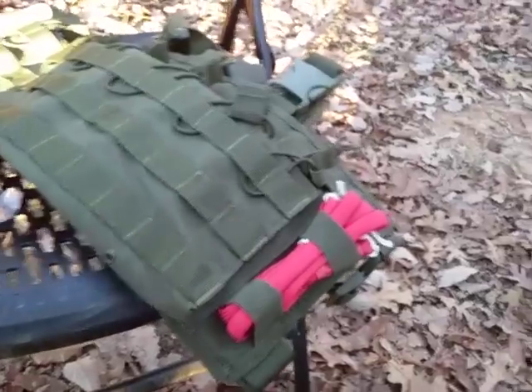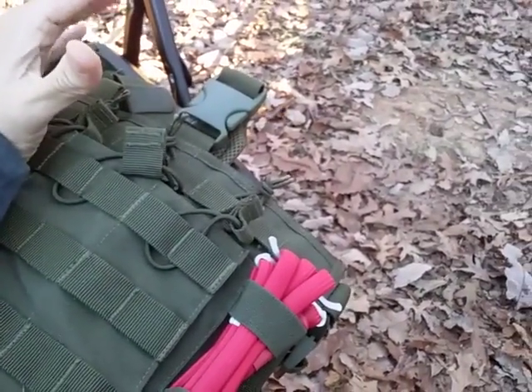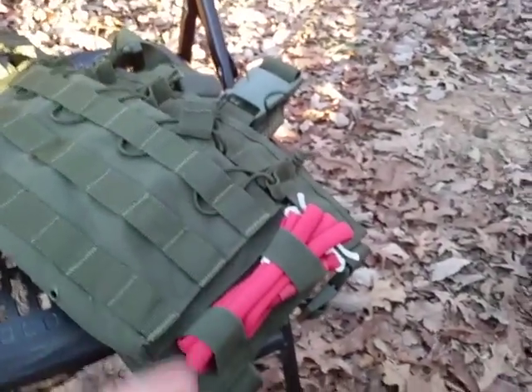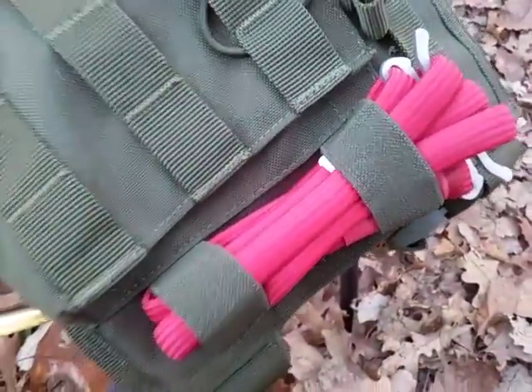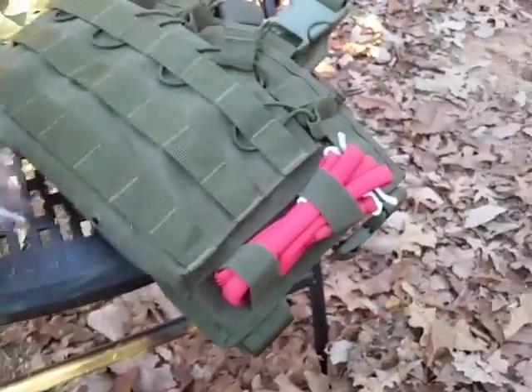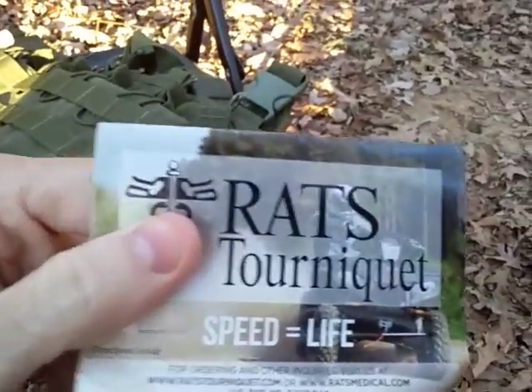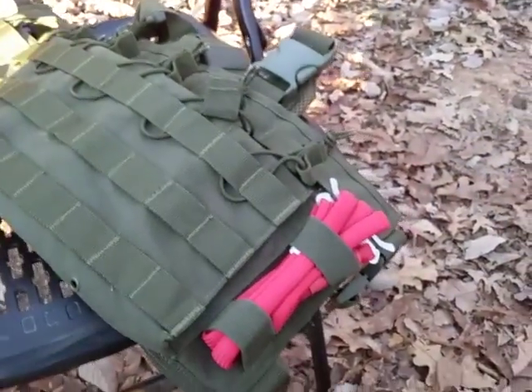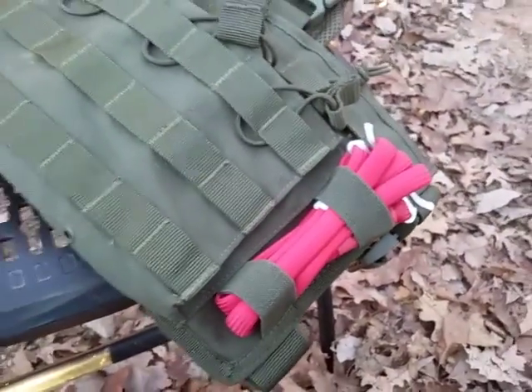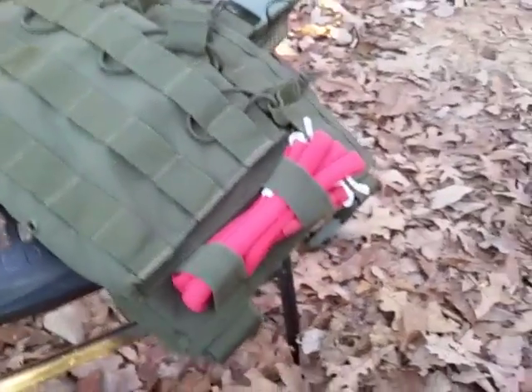It's just a different configuration. Those SOF-Ts are a little more complicated. They can still be put on one-handed, but you have to practice a bit more than something like this. This is a lot simpler in design. So I just wanted to introduce this and encourage you to start researching more about trauma gear and medical. Preppers are typically deficient in medical knowledge and trauma gear, and that's something I see over and over.